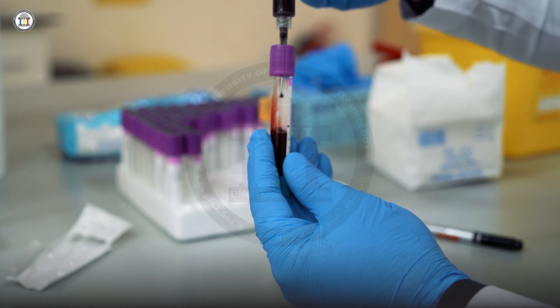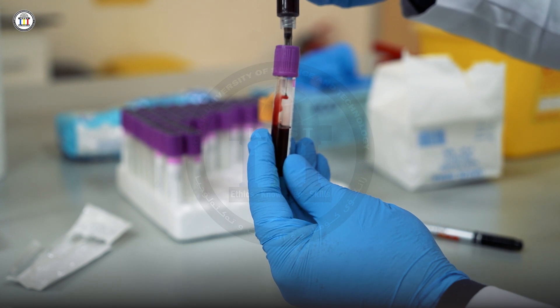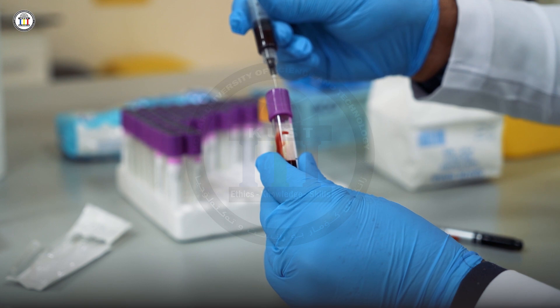If you press it, the blood will hemolyze — that's why I'm going to press only slightly, because you have a narrow lumen of the needle. Once you have reached the fill line, slowly remove the needle.